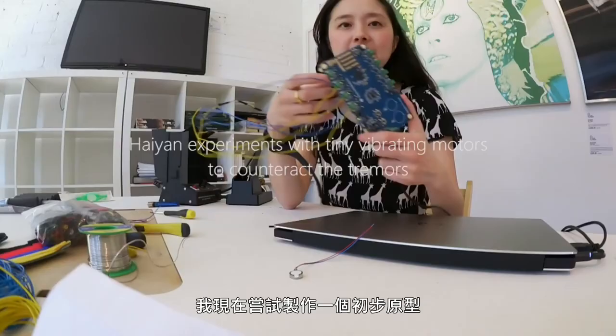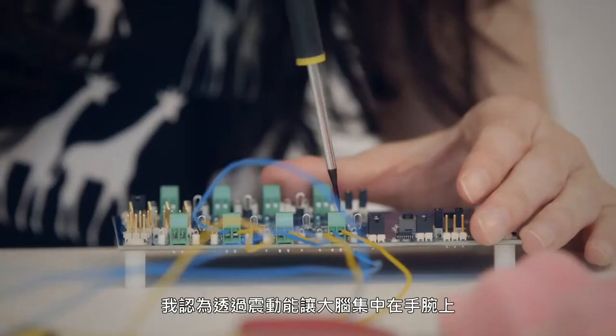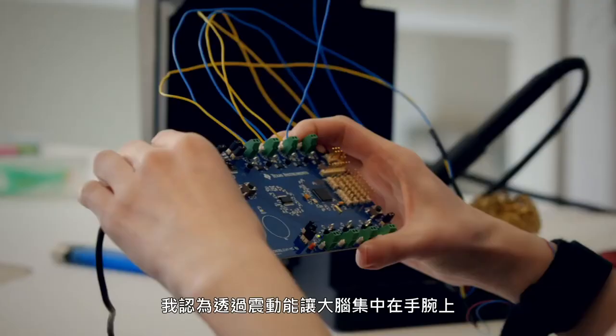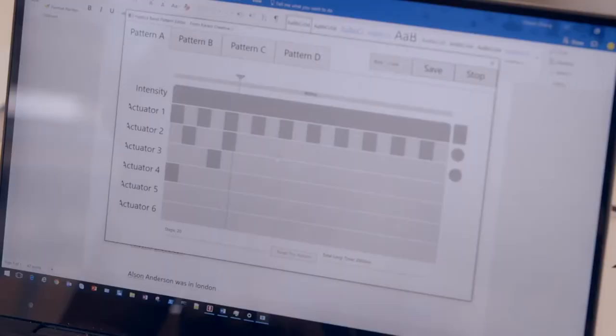What I'm doing is I'm making a very rough prototype. This board lets me connect into it through these wires — these tiny coin cell motors. These motors will vibrate. I personally think this is short circuiting whatever feedback loop there is between the brain and the hand that's causing the tremors. So the idea is: if you are distracted by the vibration, are you able to write better? I don't know.